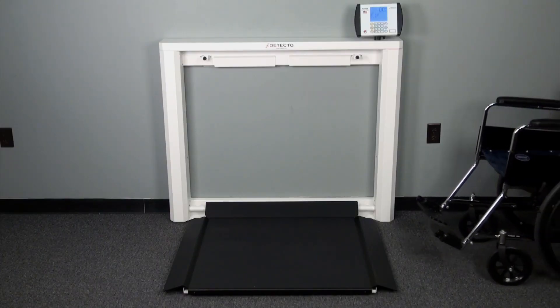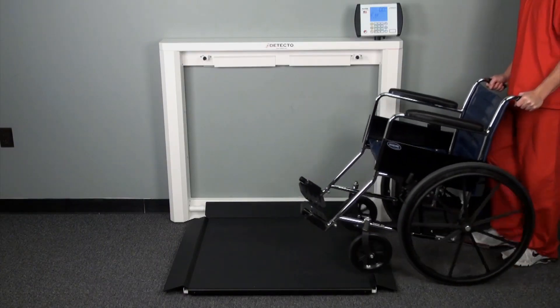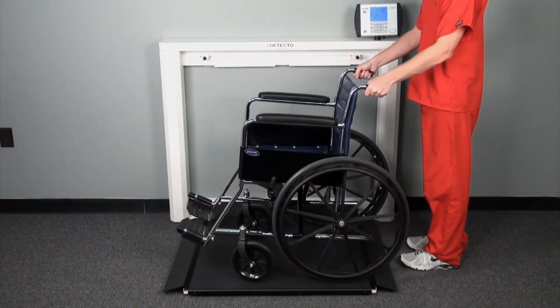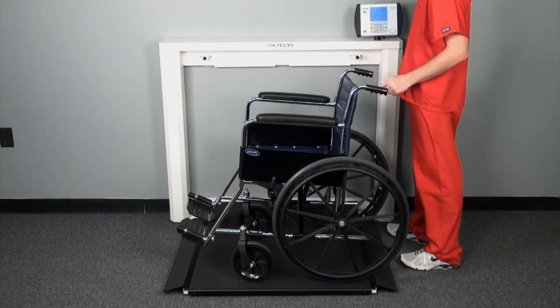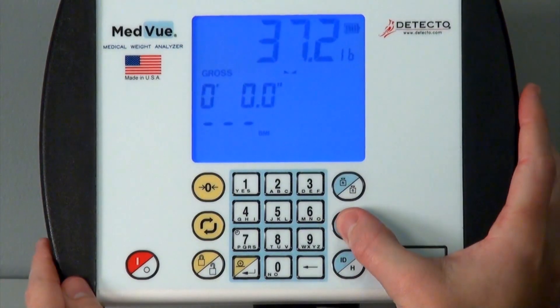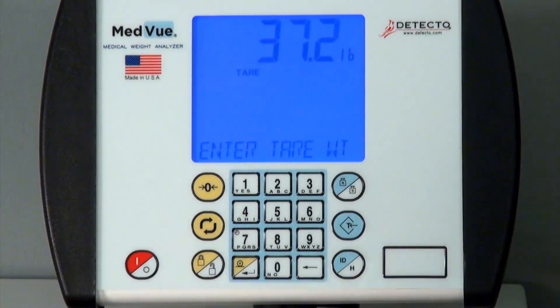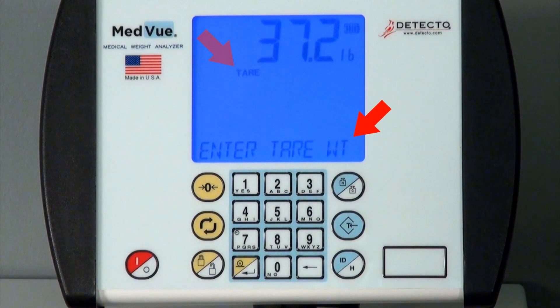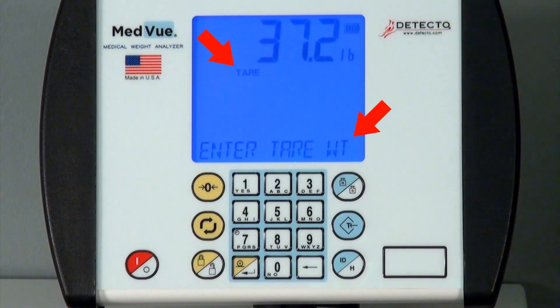When the tare weight of the wheelchair is unknown, begin by placing the empty wheelchair onto the scale. Press the tare key on the indicator. The display will change to Enter Tare Weight, the weight of the object will be shown, and the tare enunciator will toggle on.